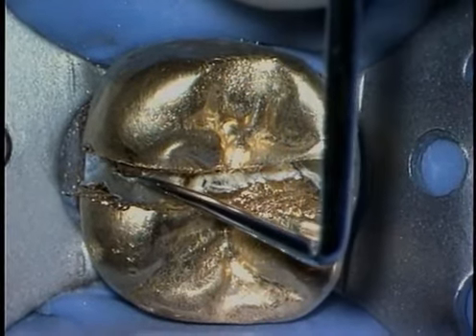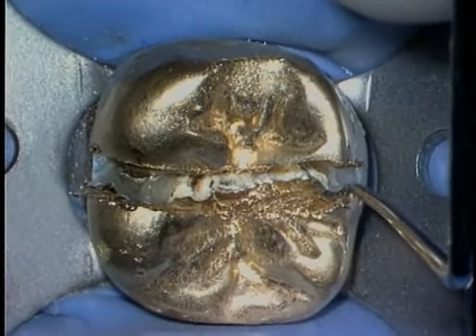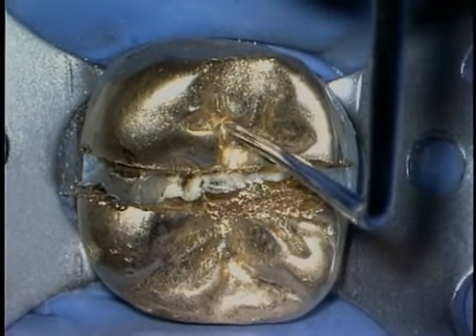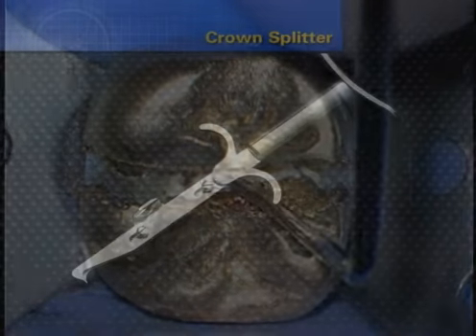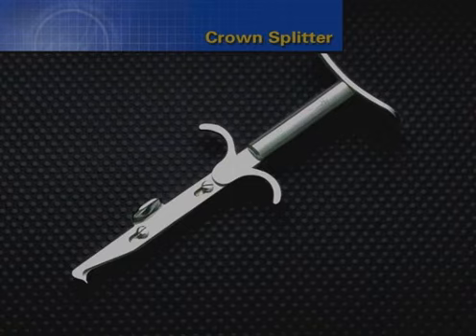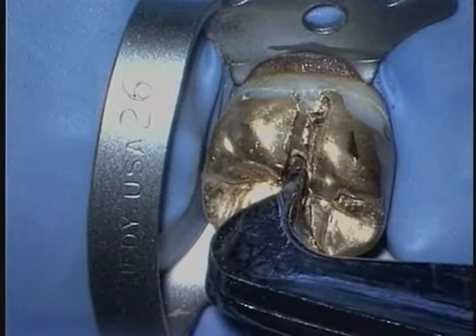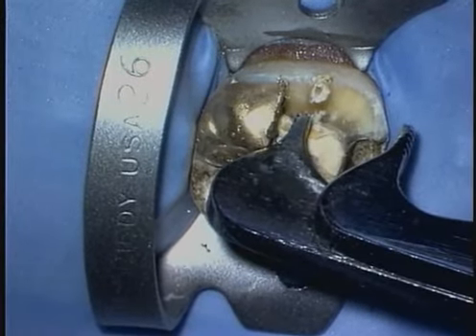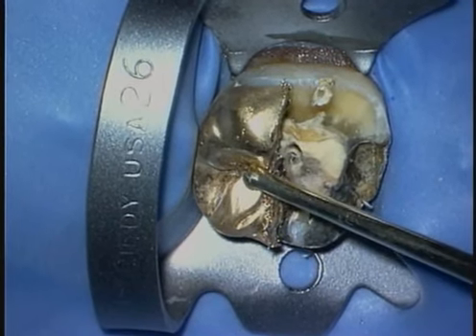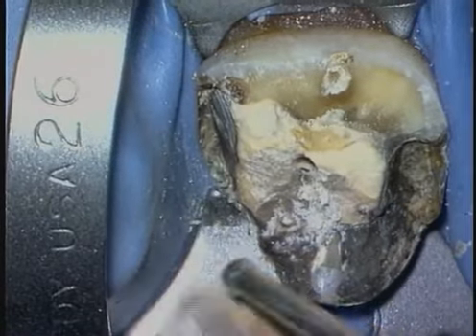Assess your sectioning and make sure you're completely through the metal from the buccal to the lingual. If that's the case, then the sectioning tool can be placed in between the mesial and distal halves, and then we can generally dislodge one or both halves. The crown splitter has a wedging device at its working end that, when activated, will effectively dislodge most restorative segments. Carefully insert the instrument and with handle pressure, you can generate the dislodgement force. Typically, one half will stay, so ultrasonic energy is very useful to vibrate and dislodge that piece.